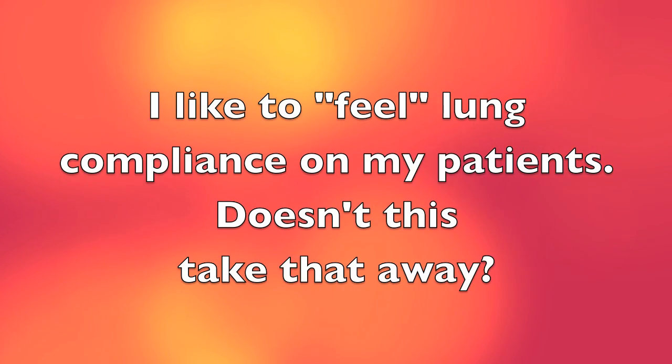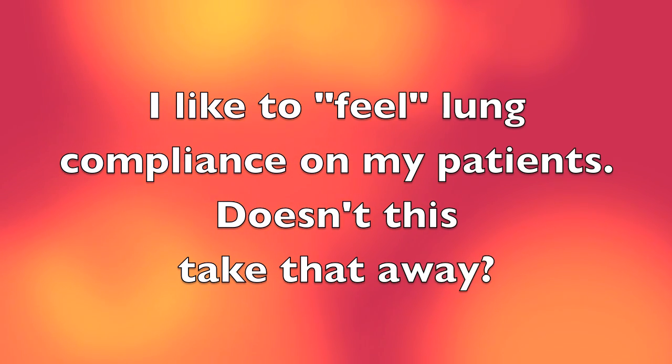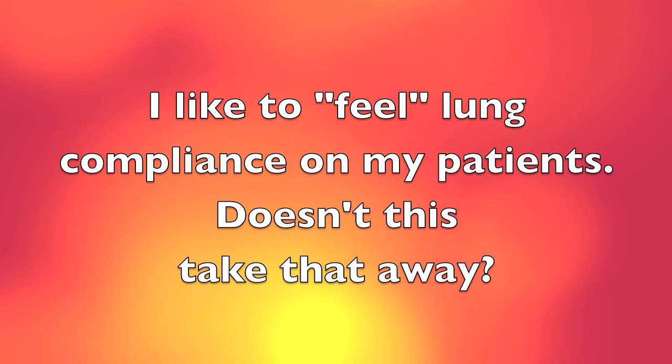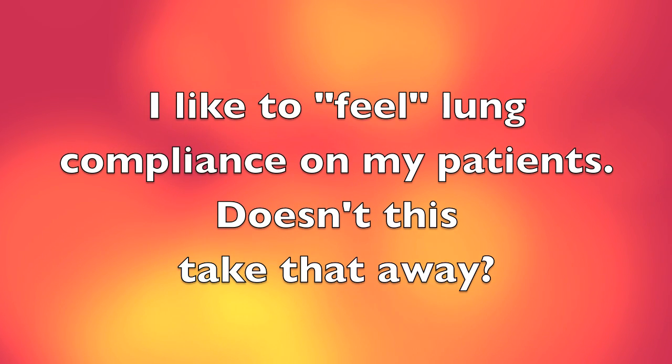Changes and trends in the patient's ventilatory condition will be evident through changes in the manometer, the patient's ventilatory rate, and on the end-tidal CO2 monitor. These monitoring devices are typically much more sensitive to changes in the patient's condition than the typical bag valve mask operator. This is certainly true if the lead care provider or person in charge of making patient decisions is not the person with their hands on the bag valve mask.